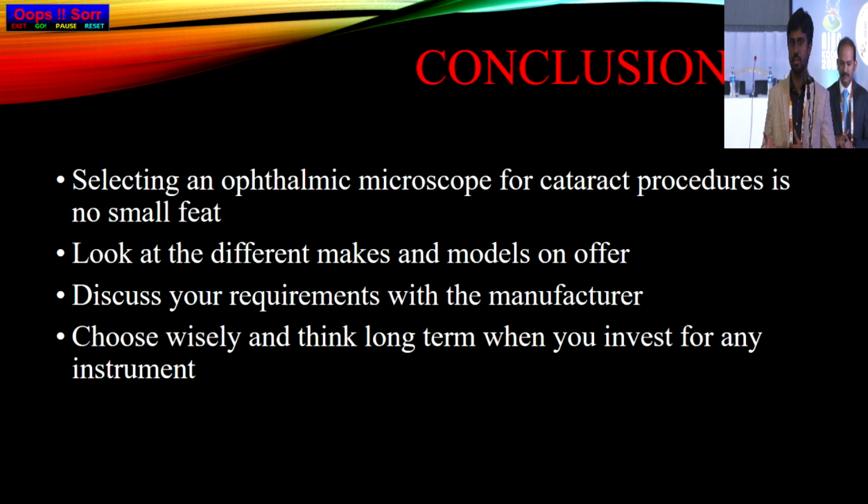I'm from Chennai. I think in Cochin also there will be a lot of humidity related issues. So if you close your microscope, fungus is an issue. You don't operate for 10-15 days. During COVID time, we had that issue. I shut down for 1 month and that was happening.